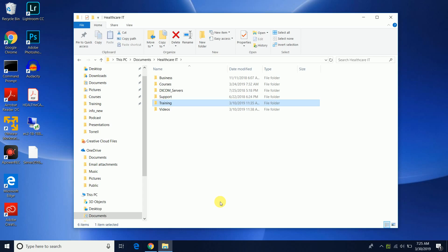This is helpful if you actually need to look at the contents of a DICOM file, the need to review certain DICOM tags for troubleshooting. The DICOM dump can be useful to display those DICOM tags, private tags, whatever is sent over that's inside of the DICOM file.